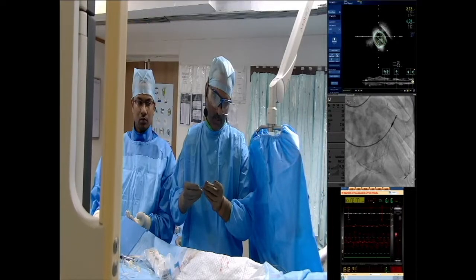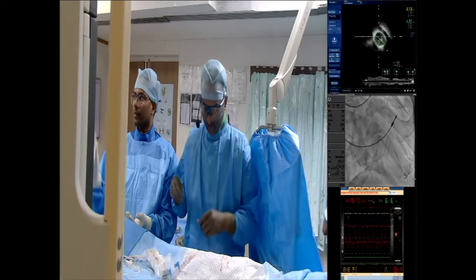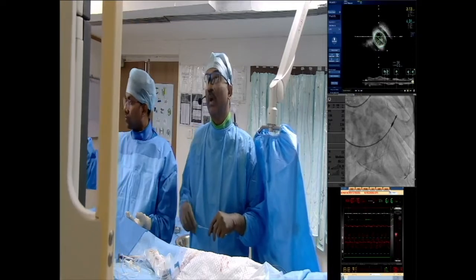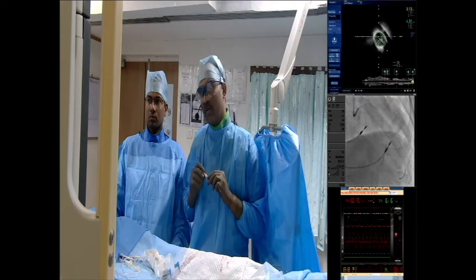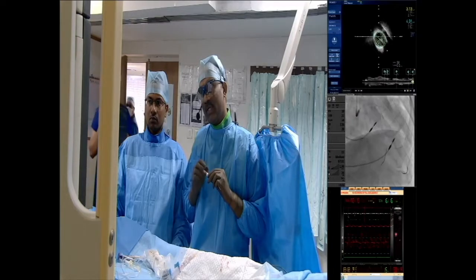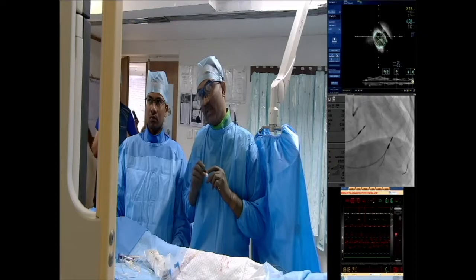So first we'll explore the distalmost septal branch, which looks quite well connected. This is what I thought of trying first, and it's completely following the course.